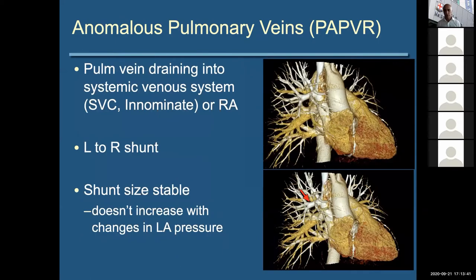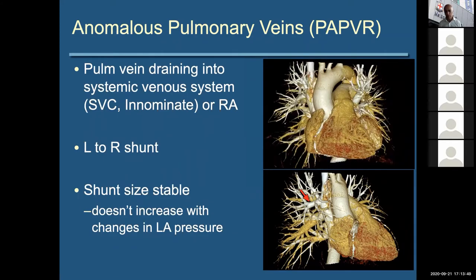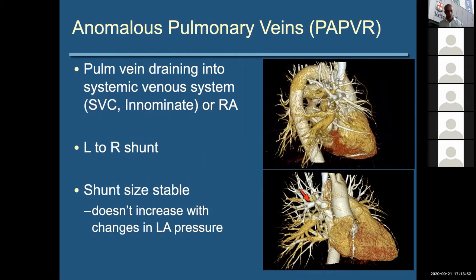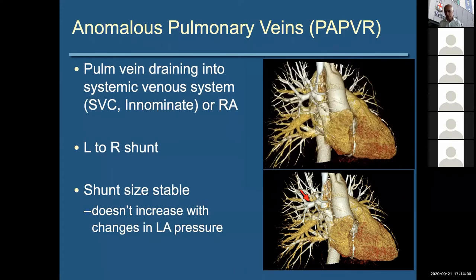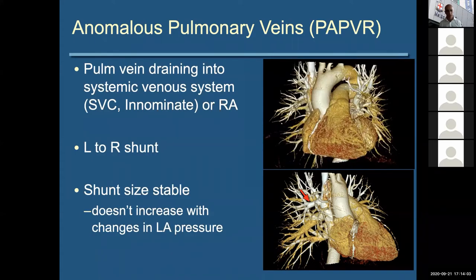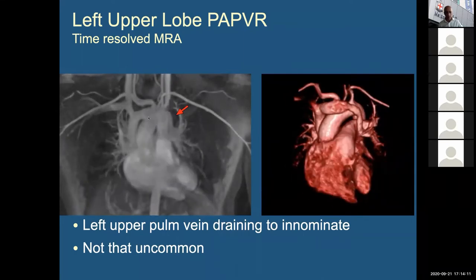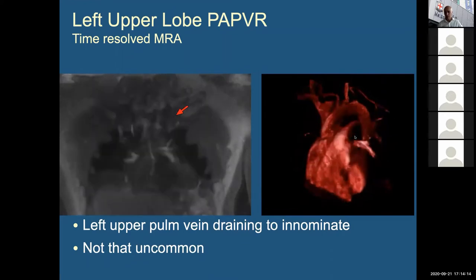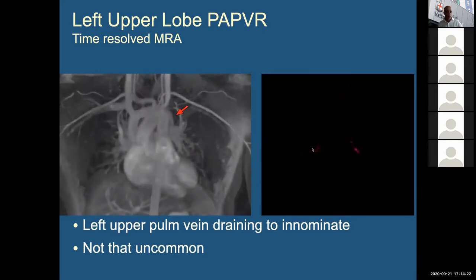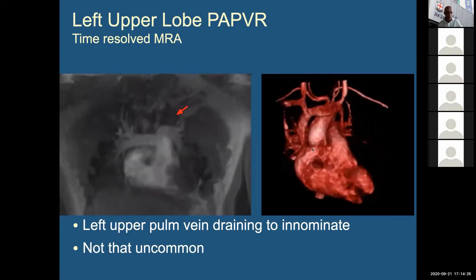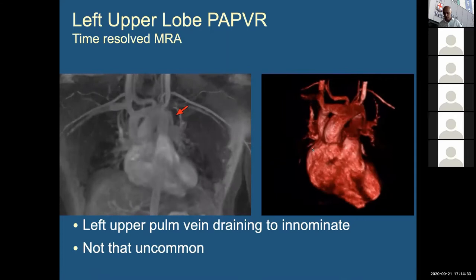You can also get anomalous pulmonary venous drainage without an intra-atrial communication — that is, without a sinus venosus defect component. These are actually commoner than you might think. They result in a left-to-right shunt, a bit like an ASD, but the shunt is stable because it doesn't change with changes in relative atrial pressures. Here's a patient with an anomalous left upper pulmonary vein draining into the innominate, shown in a time-resolved MRA rendered in 3D. This really isn't uncommon — we turn it up not infrequently, and it gets missed a lot because you can't even see it on transoesophageal echo. Unless you do a CT or MRI and go high enough, these will just get missed.